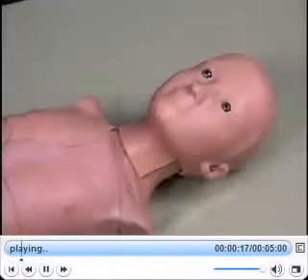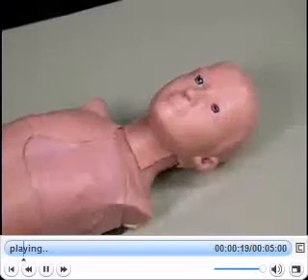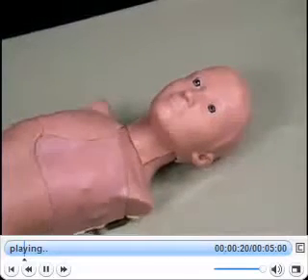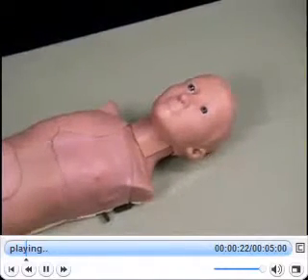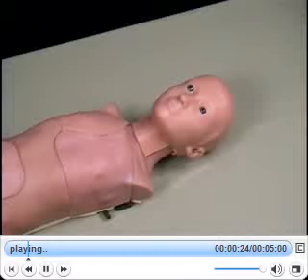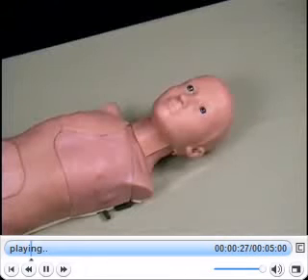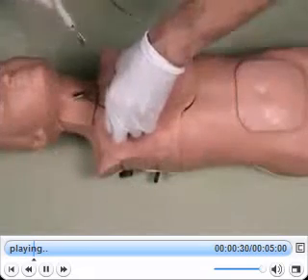Meet Trauma Child. Created in the likeness of the Trauma Man system, the world's most widely used surgical simulator, Trauma Child is a pediatric simulator designed to train advanced trauma surgical skills.